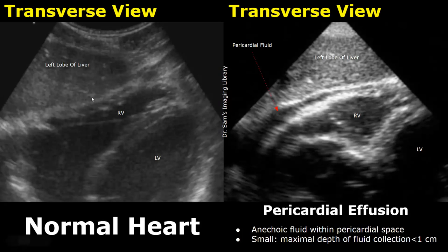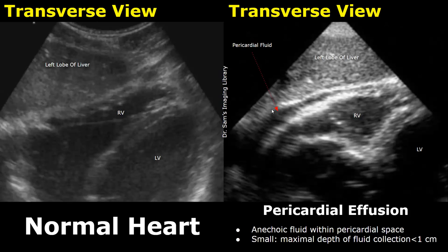The left lobe of the liver is used as a window to scan the heart. The right ventricle is seen first, and this is the left ventricle. The second image is of pericardial effusion — there is some anechoic fluid within the pericardial space. The maximal depth of the fluid collection can be measured to determine the severity; a small pericardial effusion is less than one centimeter in maximal depth.